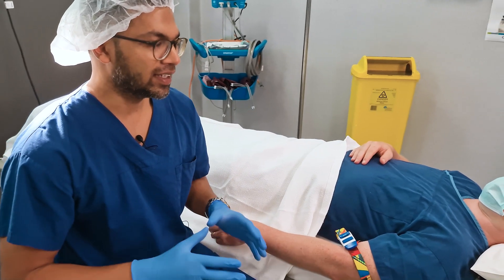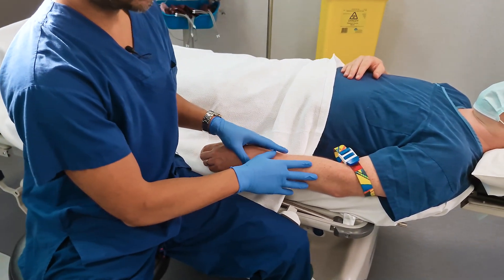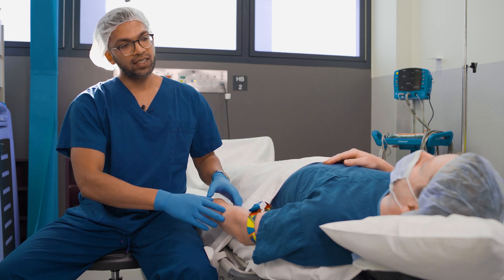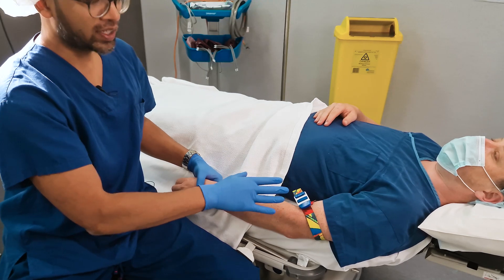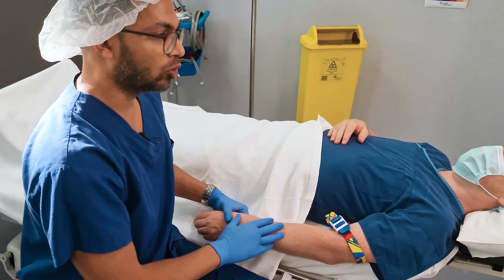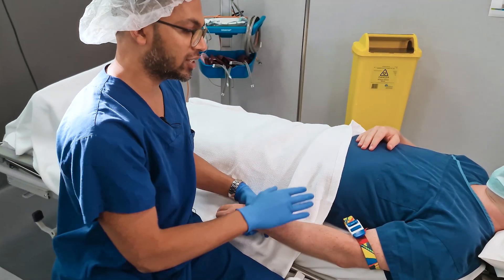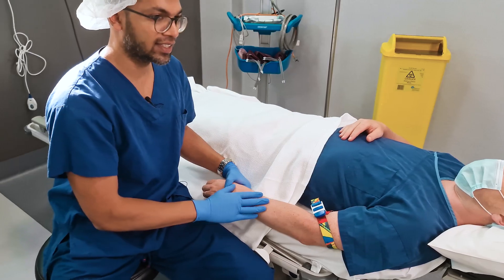I'm always thinking about the logistics of my anaesthesia induction. In my theatre setup, the anaesthesia machine is on the right-hand side of the patient, meaning there's a lot of equipment and my assistant there. Often I'll be standing on the left-hand side while my trainee or assistant is managing the airway, so I want to be able to give medications easily without reaching over the patient — which makes a left-handed cannula great, depending on your anaesthetic setup.